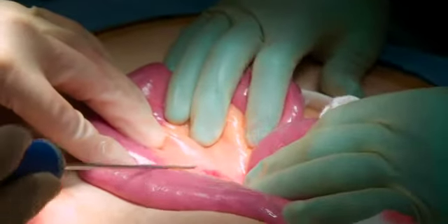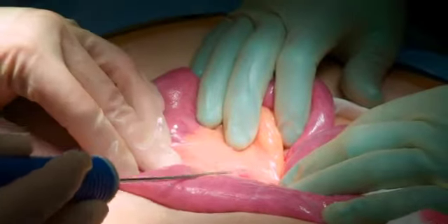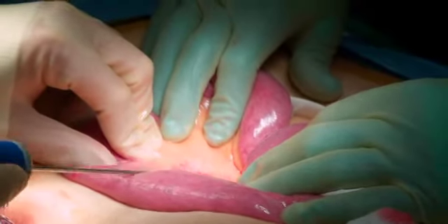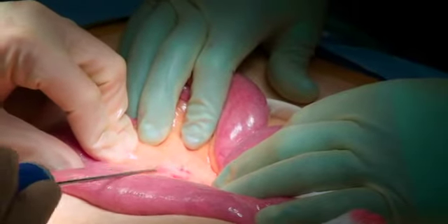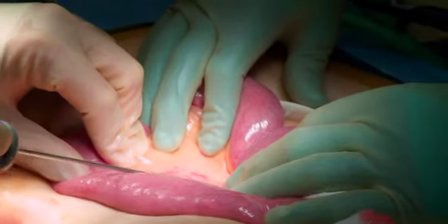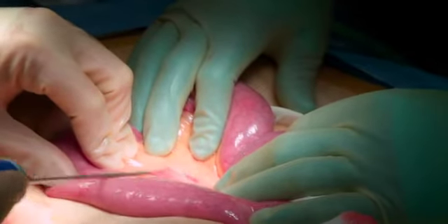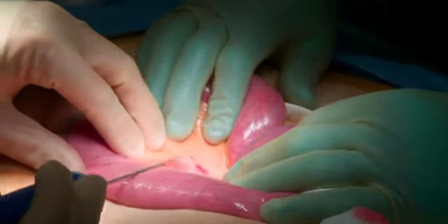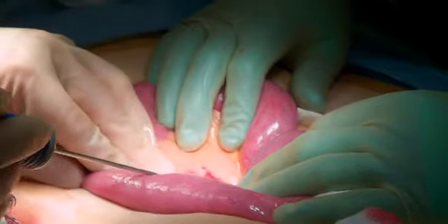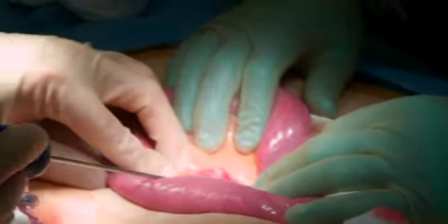I'm in it now. You see that clears it up as it goes. It makes it translucent as the fat is extracted. You see through there, you go from there to something like that. And you're using sort of a sweeping or windshield wiper motion? We are, and we're keeping the aperture of the cannula at the 12 o'clock position. We range it between 12 o'clock and maybe as much as 10 and 2, right? We don't really want to turn it upside down at 6 o'clock because the vessels and things like that are there.